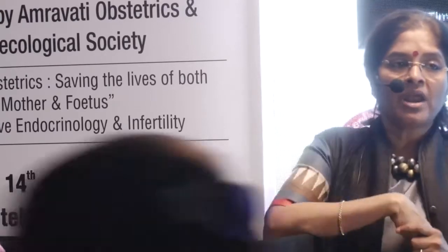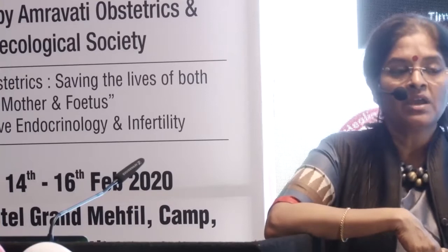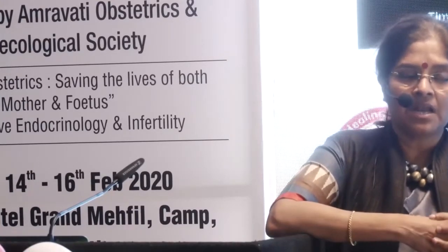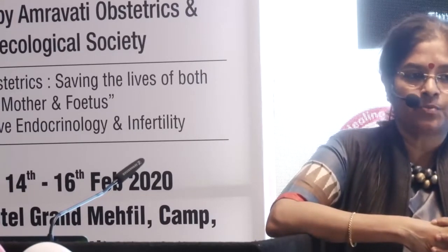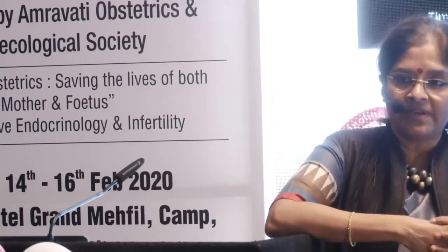So in short, there is nothing like a screening third trimester scan which we do for all the antenatal patients, but if there are any high risk mothers or high risk fetuses, then a third trimester scan surely has got a value. When you have a certain question in mind, it definitely gives an answer. Therefore, we have to be very, very selective in which population we do this third trimester scan to enable us to give an optimal fetal outcome.